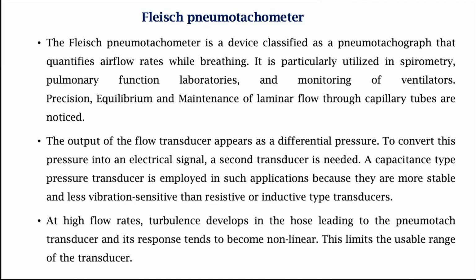Next is the topic of Fleisch pneumotachometer. This is a device that is used to measure airflow rate while breathing, essentially similar to spirometry, right? And in performing the so-called pulmonary function tests, right? And in particular for monitoring ventilators. How well the ventilator is working is something that you need to do, right?